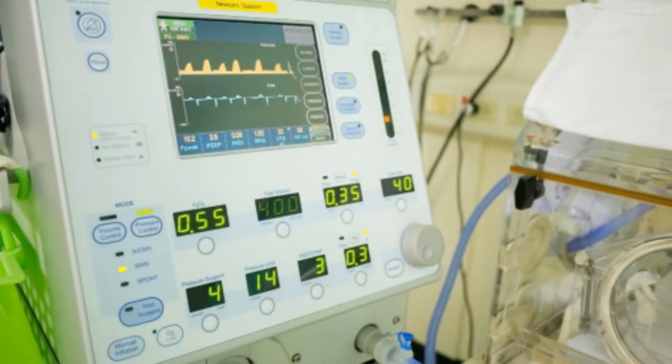So what is a mechanical ventilator? A mechanical ventilator is a device that can support ventilation in a patient who can't breathe on their own. There are many types of ventilators. You've got neonatal ventilators, pediatric ventilators, adult ventilators, home care ventilators, transport ventilators. I mean, the list goes on, and everyone swears that their particular ventilator is the best. I believe that a ventilator is best operated by the user. In other words, the skill of the person who is setting up and manipulating the ventilator is what makes the difference in patient care.